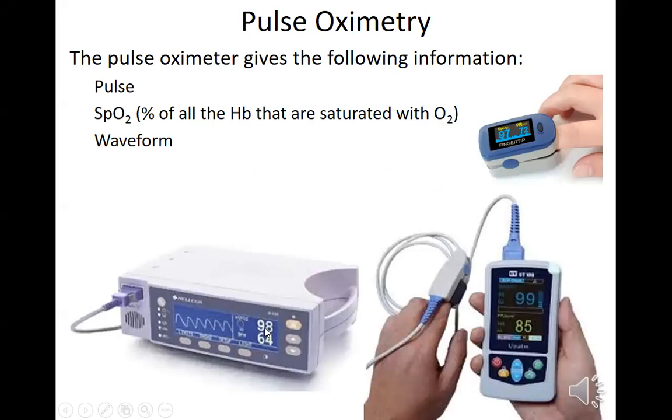Remember, the normal hemoglobin saturation with oxygen should be between 95 and 100. It should be over 95, because if it's at 90, that should be a time when you're in the ICU. That's an ICU point. Arterial, remember this is all arterial. If it goes as low as 75, you're probably looking at cyanosis.